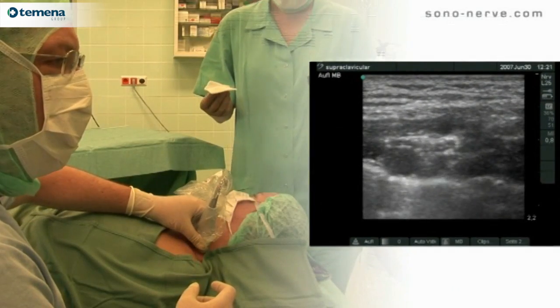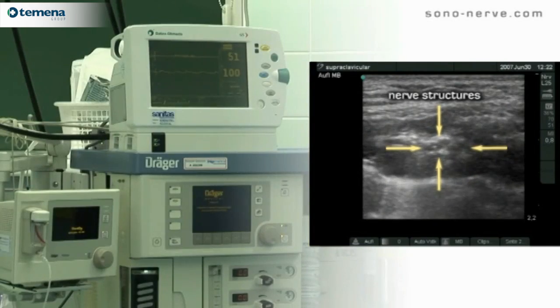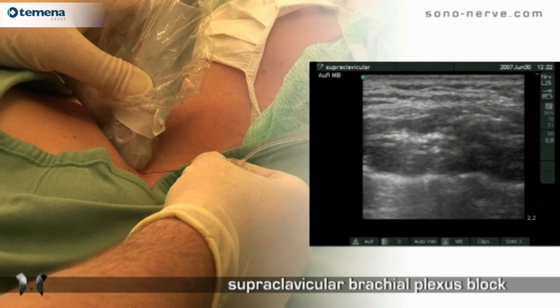We use a 25mm linear probe with a high frequency 13MHz setting. For this block we use an in-plane technique.